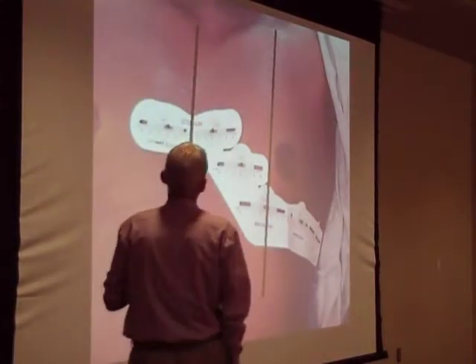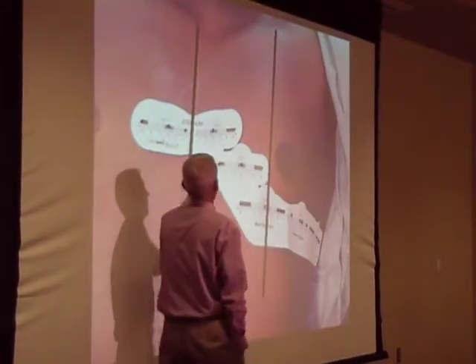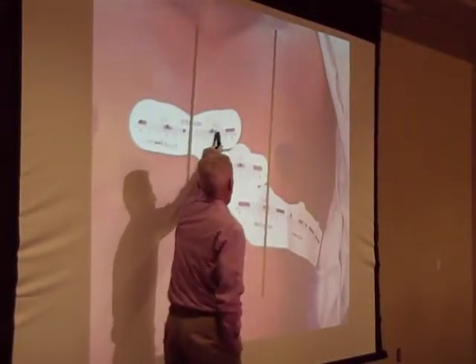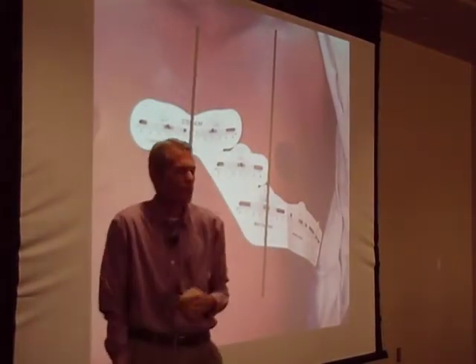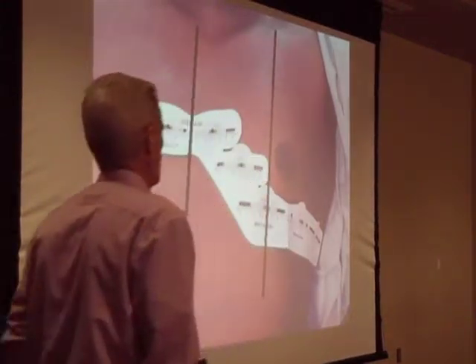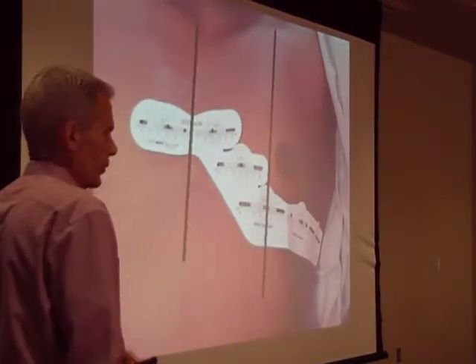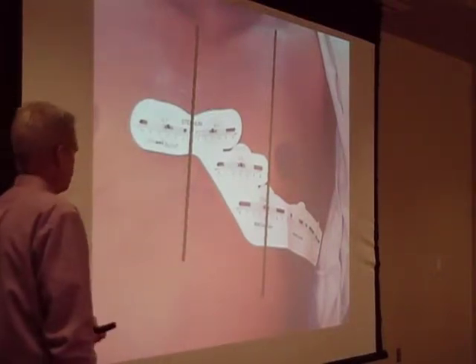But there were guides on the device itself to get it centralized to the sternum, and then these patches would slide horizontally to get them in the right spot. And it was actually more work than it was worth. So you may come across something similar to that as you navigate out there.